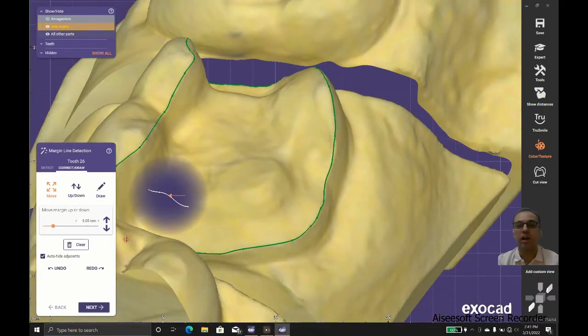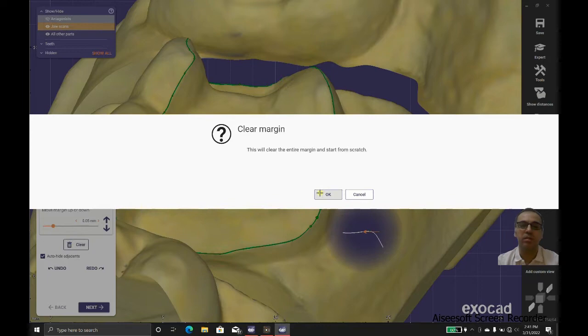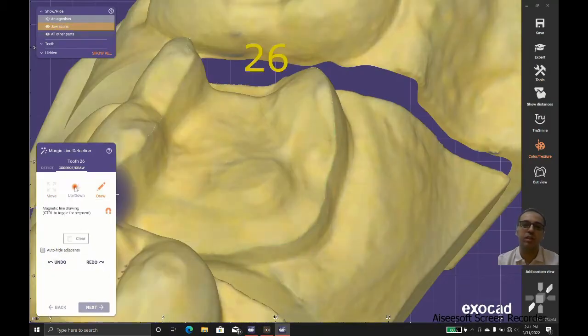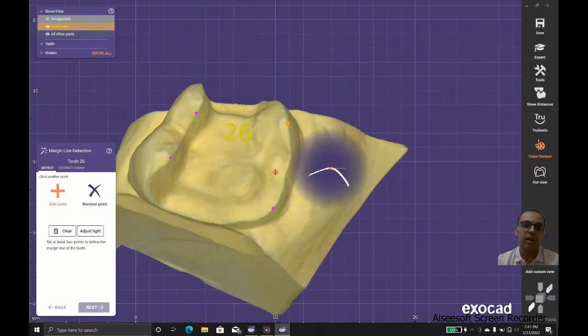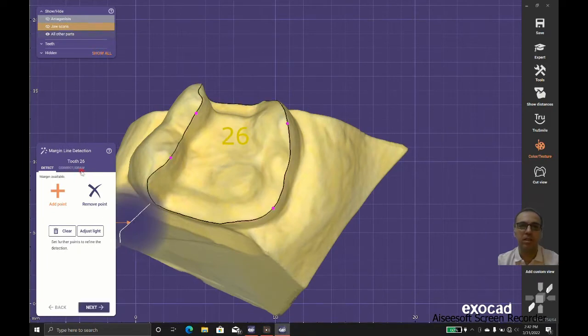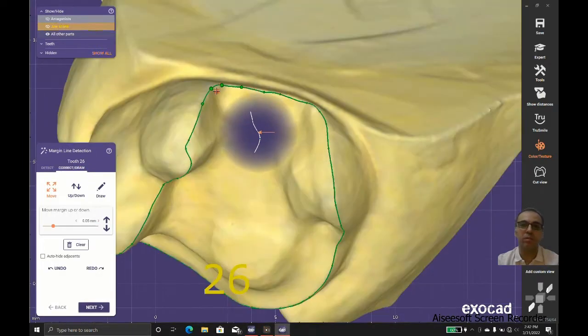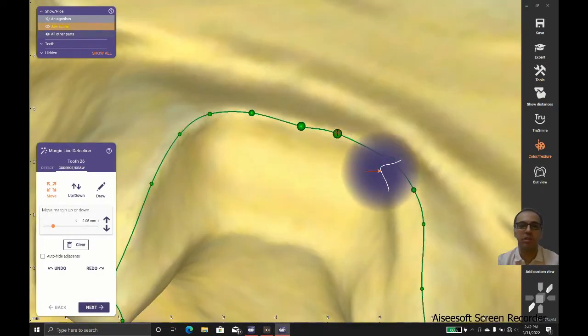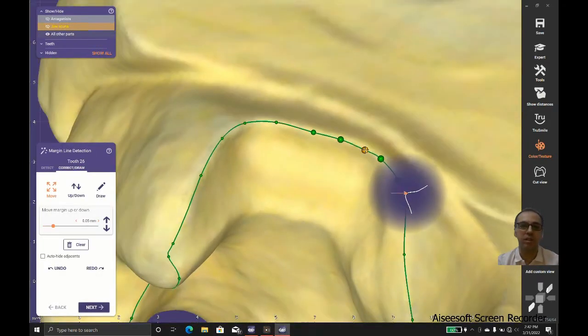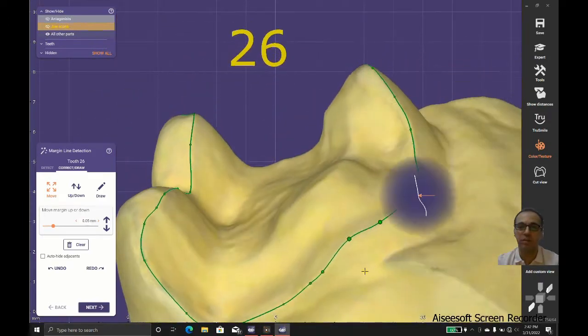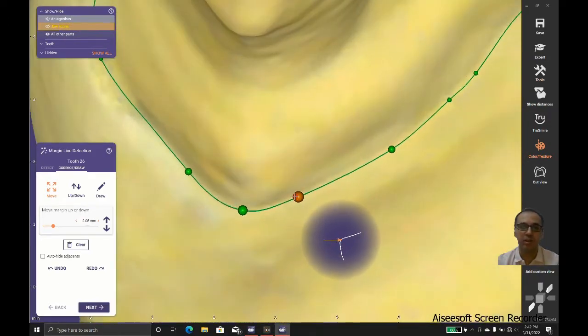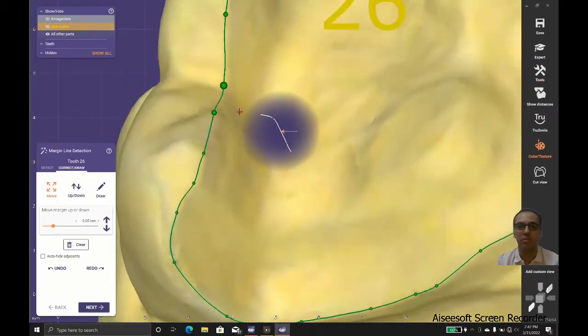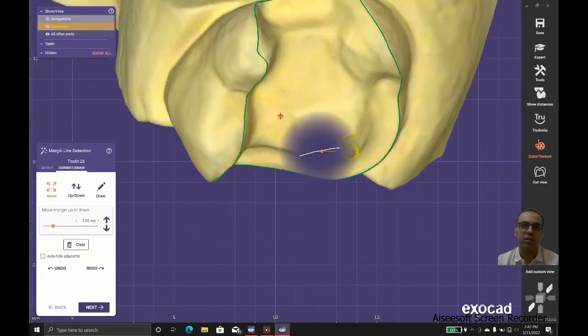In this case and in most of my cases, I use detect for start and then correct and draw for meticulous adjustment. This is the more proper margin line detection progress.